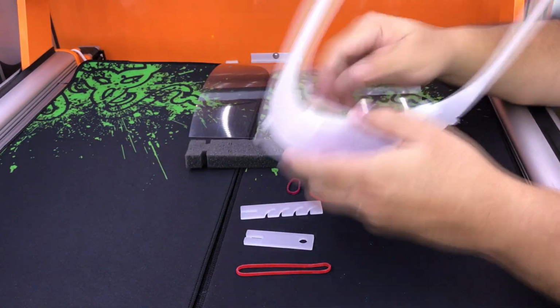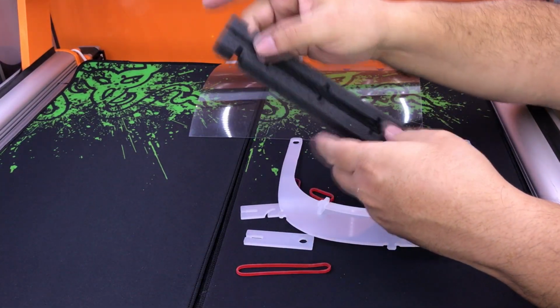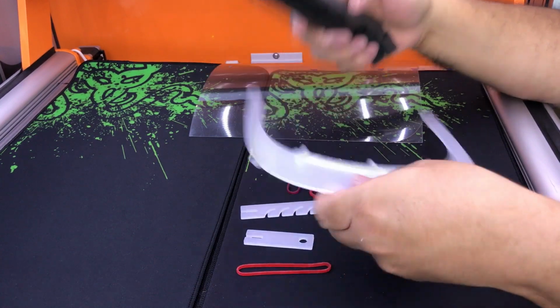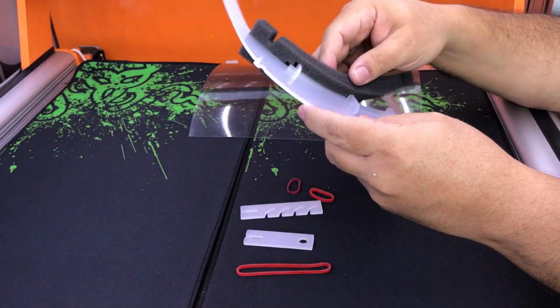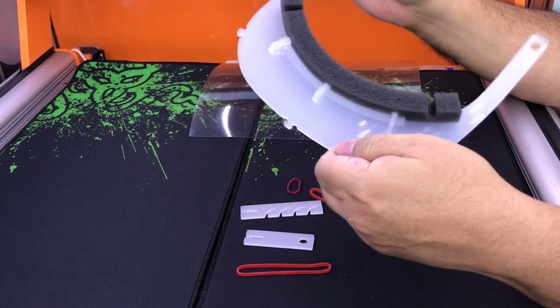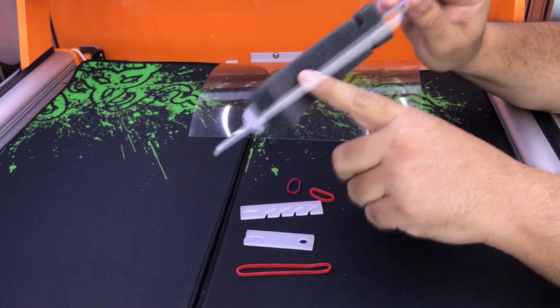Okay, so next is to hold this part. This part has a pocket made with a laser and has the same pattern as this. So when you put it, it goes like this. So it's a very nice fit, and that's how it stays here.